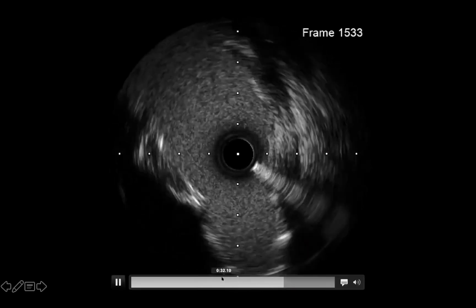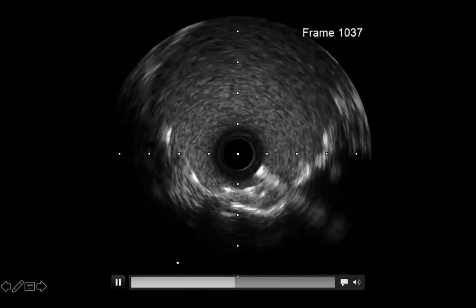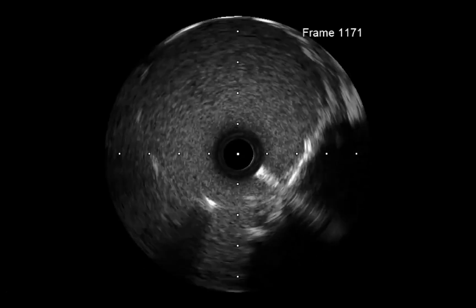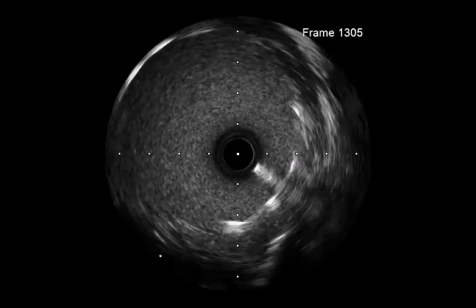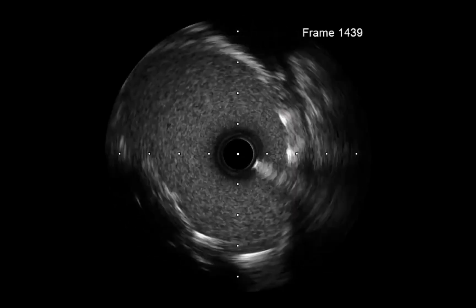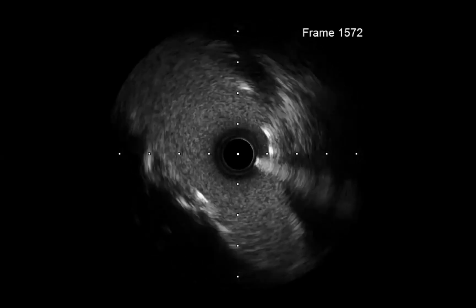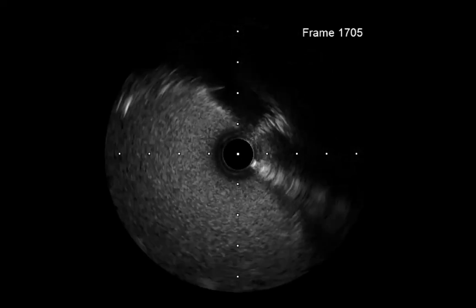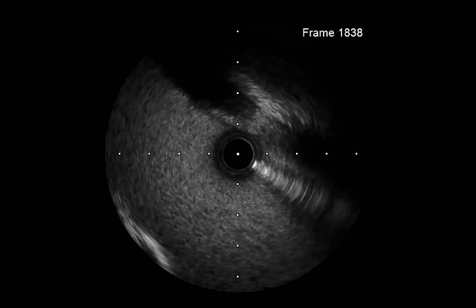So I'm just going to go back to exactly where the stent started. This is the distal left main, and now we can see some struts of the stent coming through, although we can see some under-expansion in the distal bit. But as Dr. Azim pointed out, that was the ectatic bit anyway, so no stent would stretch up to that level. Actually, we can see good stent apposition whenever the frames come through. The stent is well apposed.